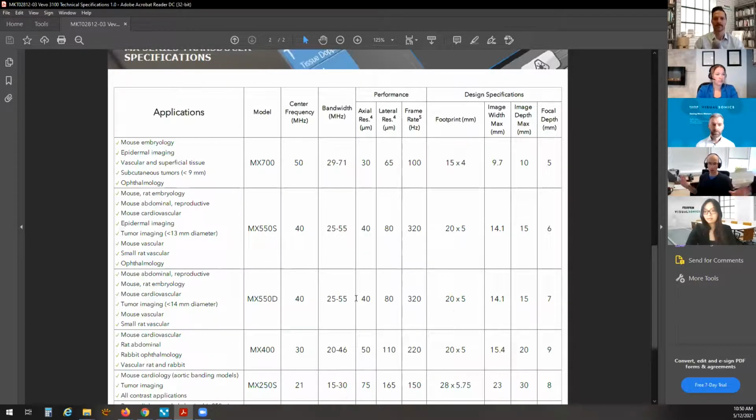Across the whole range of transducers that we have, you've got a wide range of depths of penetration and resolution capabilities, to go from a large field of view to look at the whole body, like some of the whole body images that Drew showed on the lead in. Those are typically done with the lower frequency transducers to get a wider field of view. You do sacrifice a bit of resolution, but some of the screening images, especially that mammary fat pad tumor image, are typically done at a very high frequency and a high resolution to really see those small structures as they start out.